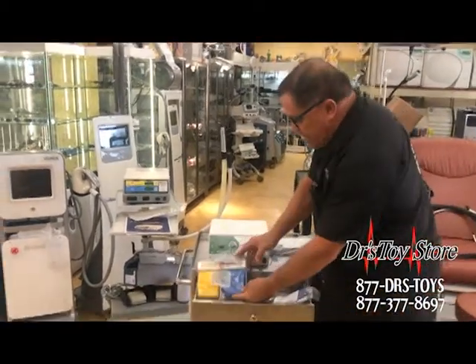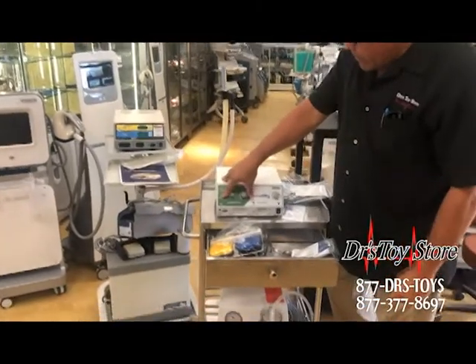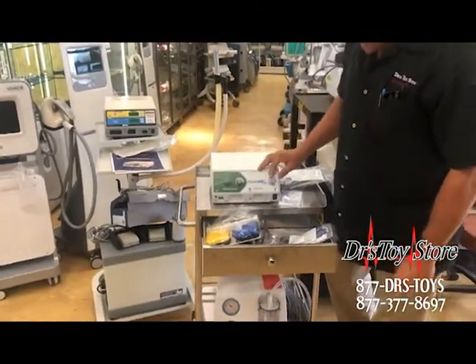These are really good. They come with the foot pedals — you've got cut, cut coag, hemo, and you have high or low so you can turn everything up or down.